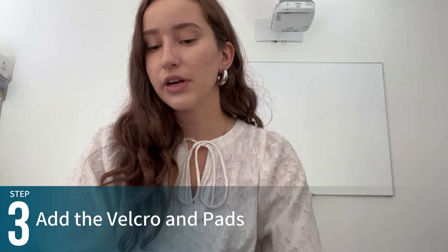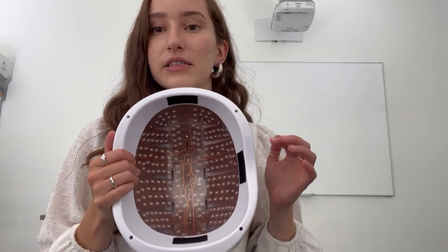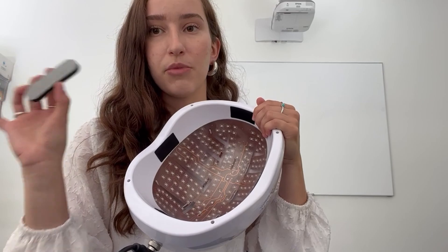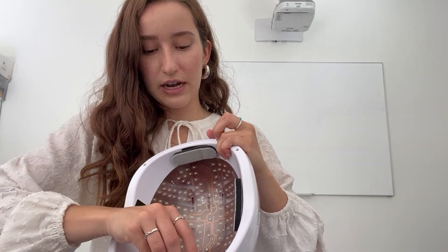One of the most common causes of problems for our clients is loose connections, so to avoid any unnecessary cost of return or delay in using your equipment, check every single attachment and make sure it is nice and snug. Another very important part of setting up your helmet is to add the pads. The velcro dots are adhesive on one side and velcro on the other — the adhesive side sticks to the helmet and the velcro sticks to the pad. Place them on the front, back, and sides of the helmet using the thinner pads, then pop the pads on. The key is that you want your helmet to be stable — not tight on your head, just snug enough that when you move your head, the helmet doesn't move with you.